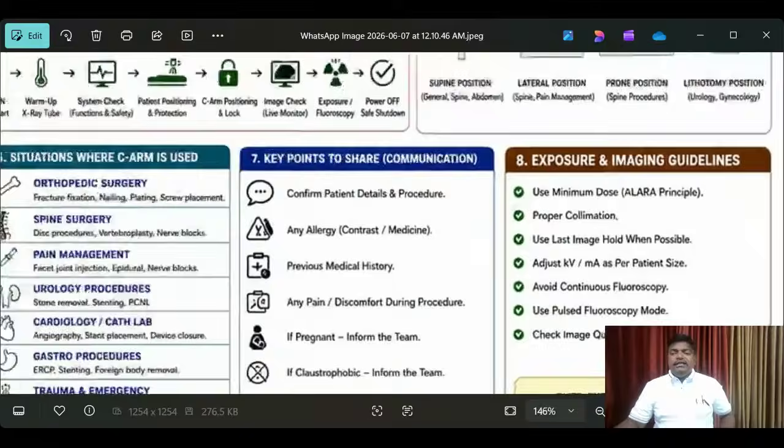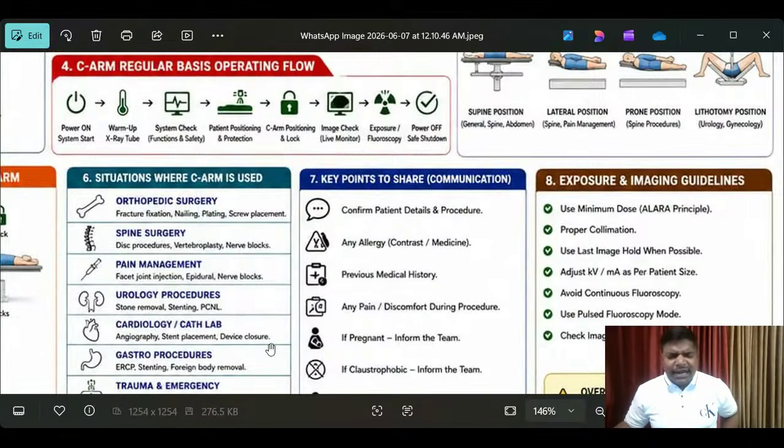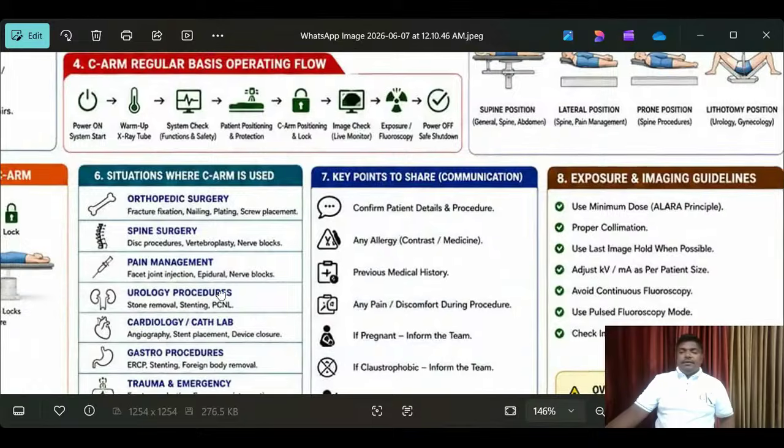See, I'm explaining all these things, but when you go to the practical side, it is very interesting. You should be very careful. Being careful is very important, because here a minor issue can create a major problem. That's why negligence matters; you should not be negligent. You should be alert, proactive, and very active. Very, very important.